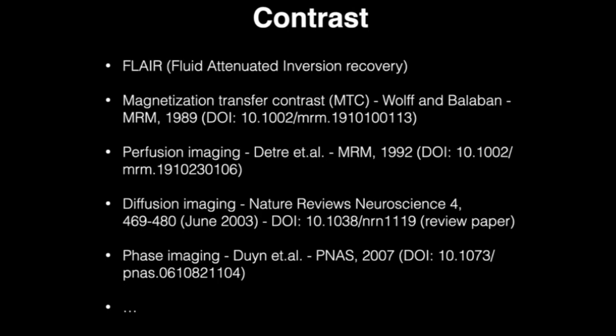And these are the couple of very basic types of contrasts that we leverage most. But MR, because of the sampling, the encoding, and the environments that we're looking at, there is actually a lot more that we don't do routinely, but is possible and available.